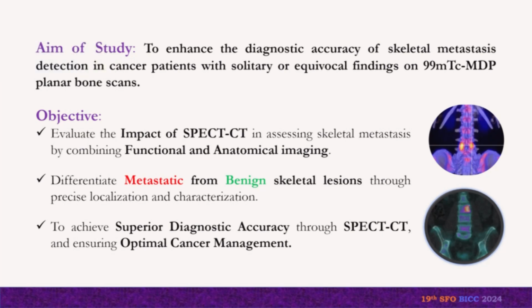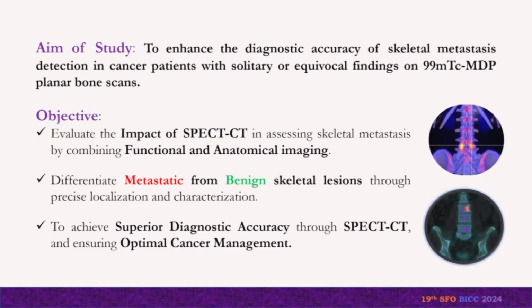Now, the aim of our study is to enhance the diagnostic accuracy of skeletal metastasis detection in cancer patients with solitary or equivocal findings on technetium MDP planar bone scan. The objective was to evaluate the impact of SPECT-CT by combining functional and anatomical imaging, differentiate metastatic from benign skeletal lesions through precise localization and characterization, and achieve superior diagnostic accuracy through SPECT-CT and optimal cancer management.